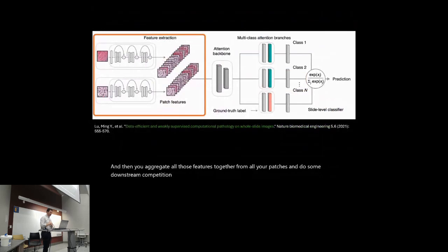And here's another similar work from my group in Boston, doing a similar thing. We extract some deep learning-based features from little image patches, and here we're using ImageNet, or another ImageNet pre-trained network to do that feature extraction.